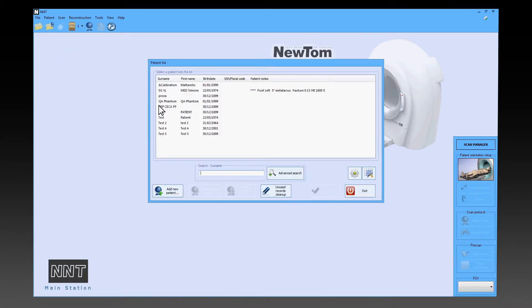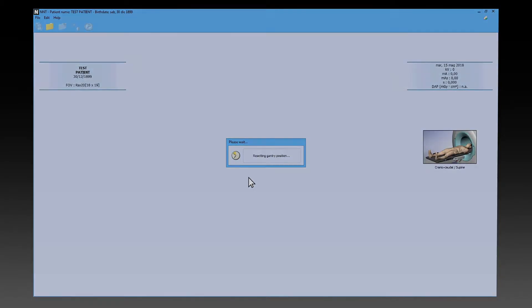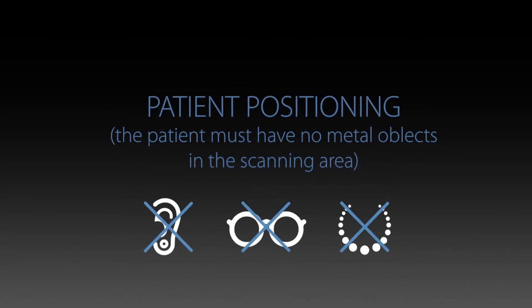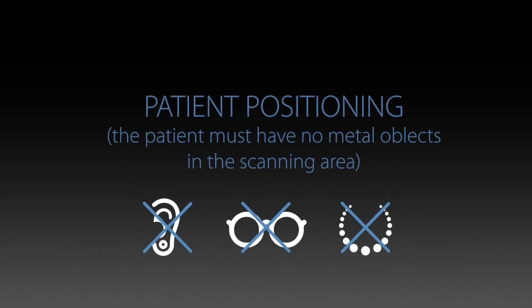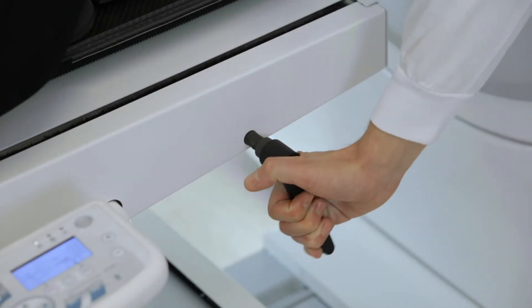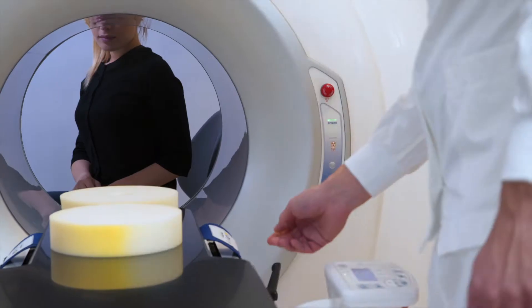While data capturing screens are displayed, the NNT software always supplies the directions to follow. Ask the patient to sit behind the appliance.